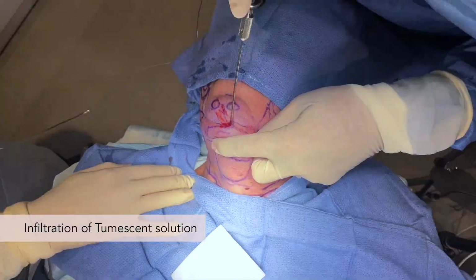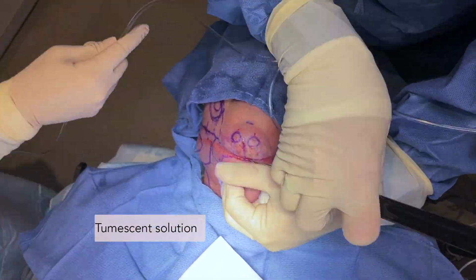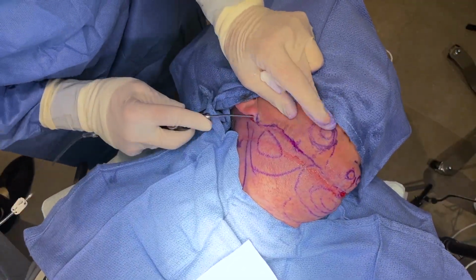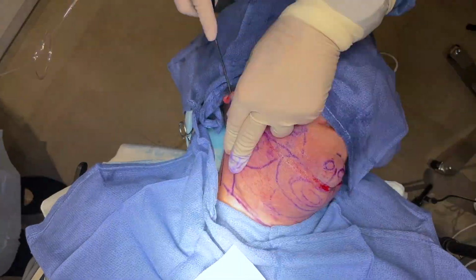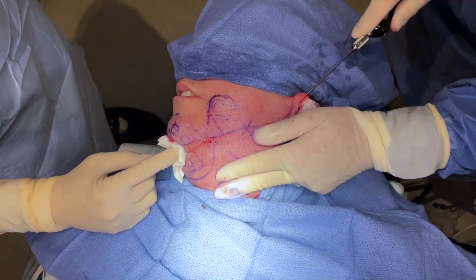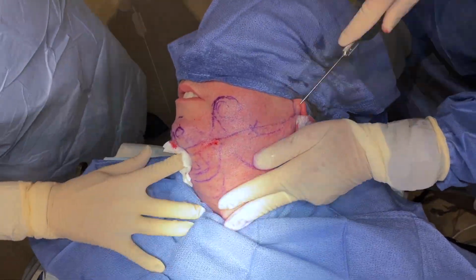The next step is tumescent liposuction, and this is the tumescent fluid that I'm injecting here, probably about 200 cc, and this is 0.3 lidocaine as opposed to 0.1 we use for the body.